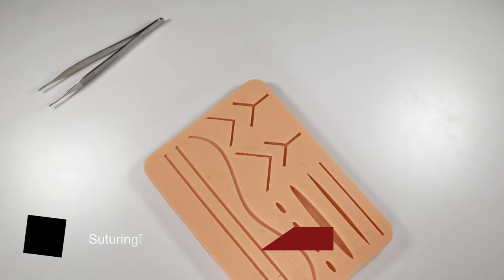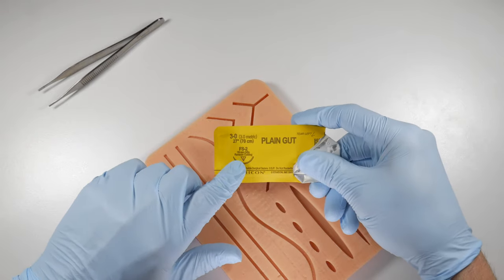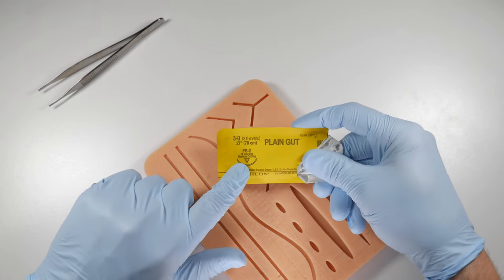Some tips now for suturing that might be very interesting for you or things that might help you would be that you want to use a reverse cutting needle. We're going to talk about this in another video, but a reverse cutting needle has a cross-section similar to what we see here.